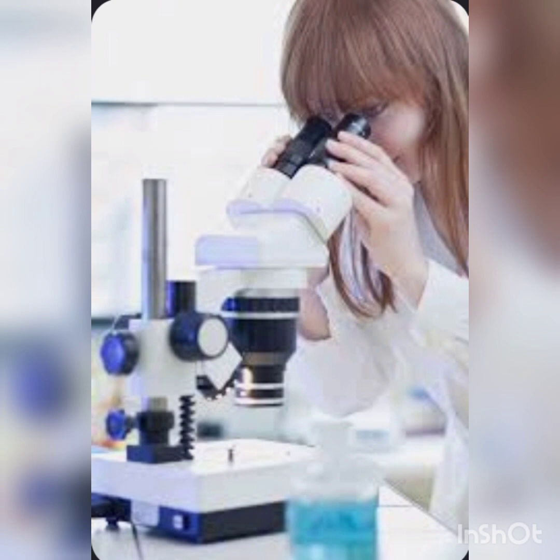Gastric washings and resected lung tissue for the culture of Mycobacterium tuberculosis need to be processed immediately without any delay, because the tubercle bacilli are very sensitive and will die rapidly. Then you cannot recognize them in the specimen and the study will fail in making the diagnosis.